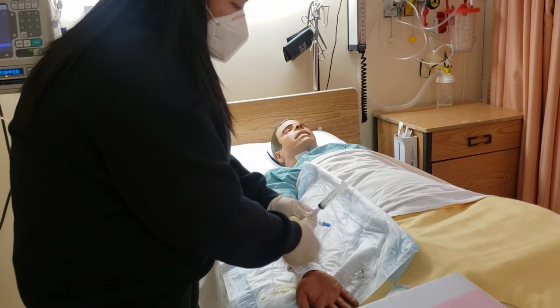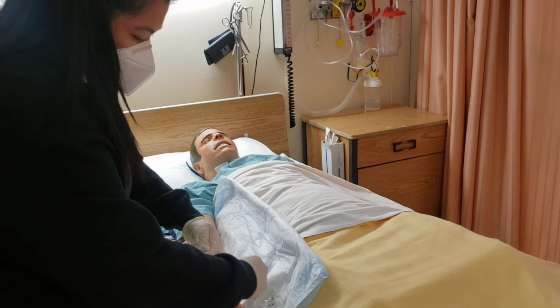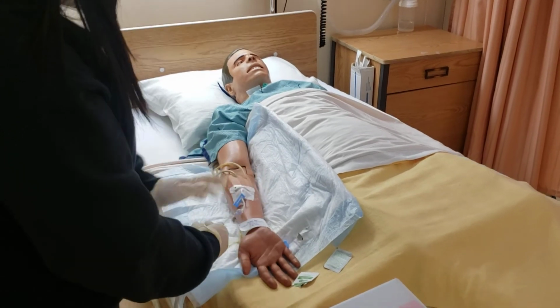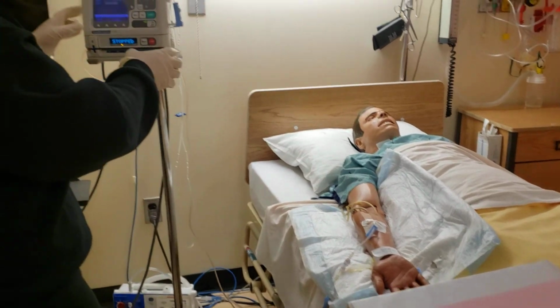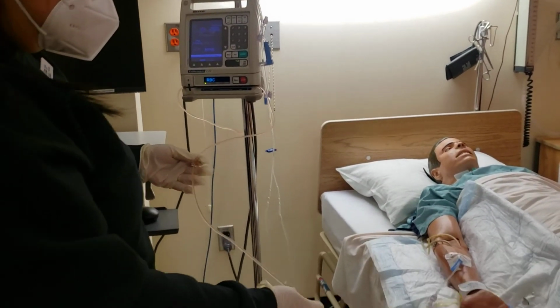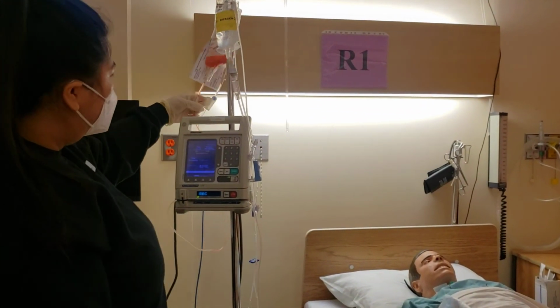We can go ahead. We will remove our flush as well as the cover for our blood tubing, maintaining sterility. We're going to connect those two together, and then we'll unclamp. Now I'm going to enter my patient, and then we can press start. Hand hygiene first. Then I want to make sure that everything is unclamped. The normal saline is clamped. The blood is not clamped.